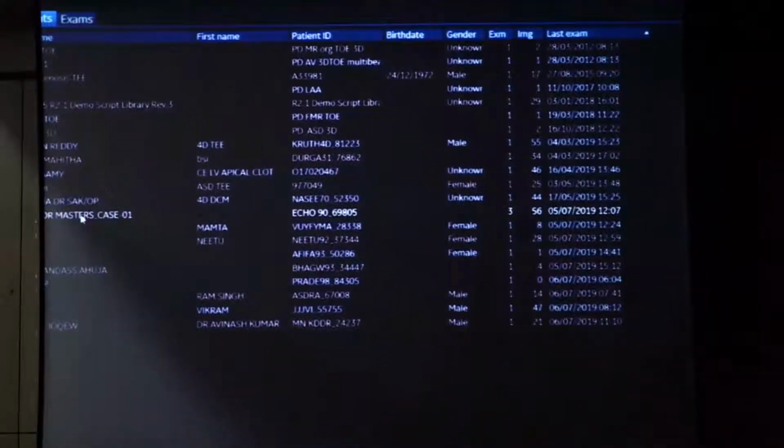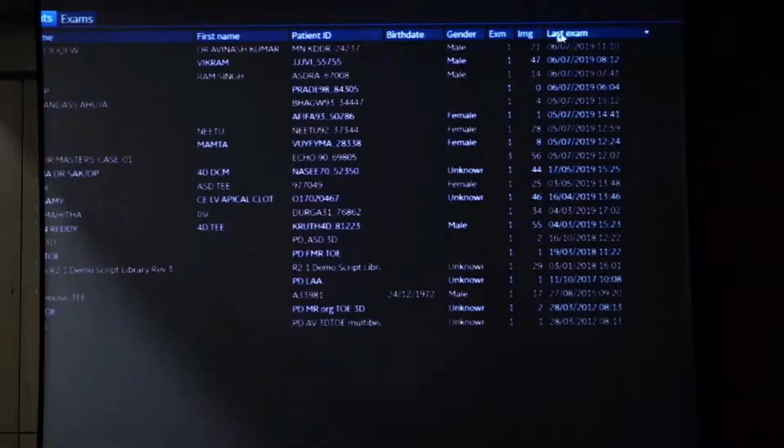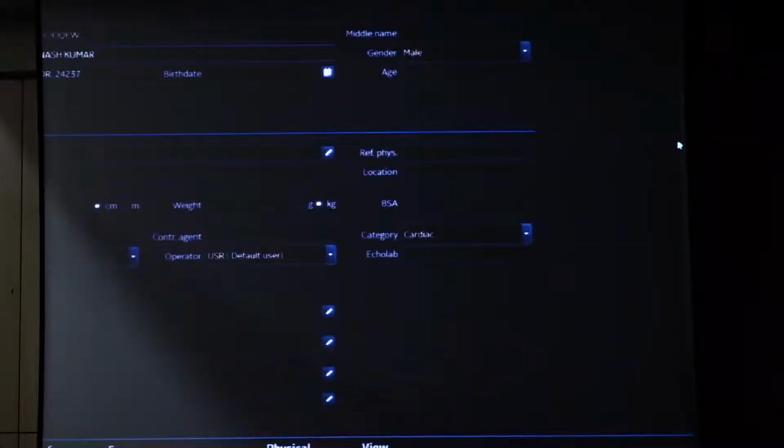Okay, perfect. One patient that has been taken, yes, one with an atrium. No, those are transesophageal. Sir wants to demonstrate that LA assessment. That is not included in that. It is there in this. Yes, this one probably. Send it. Yes. Okay.